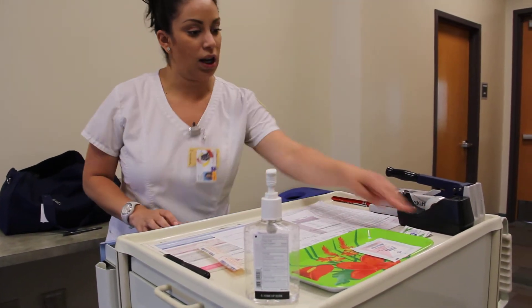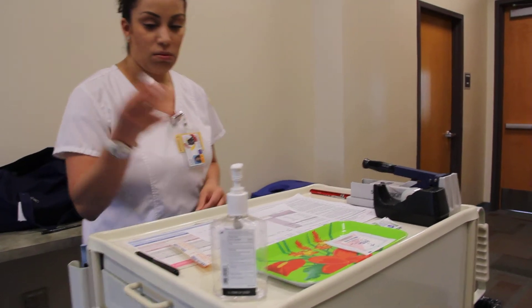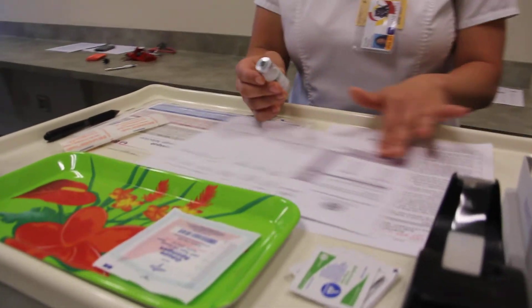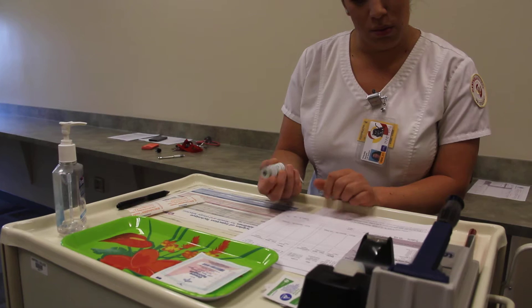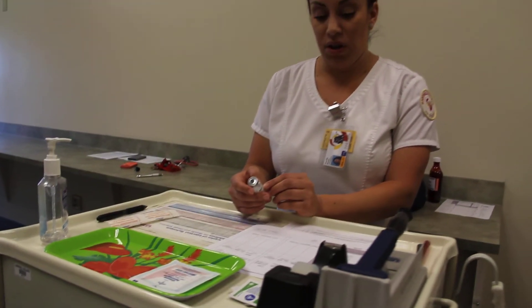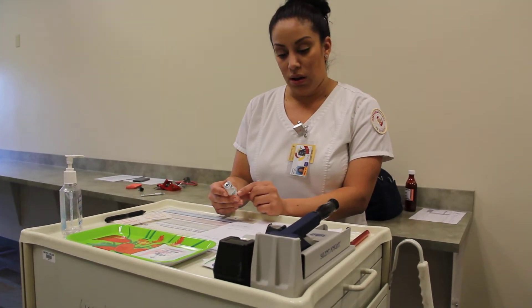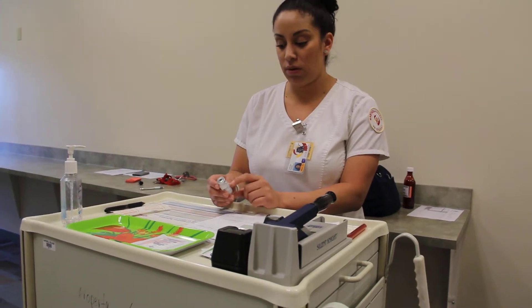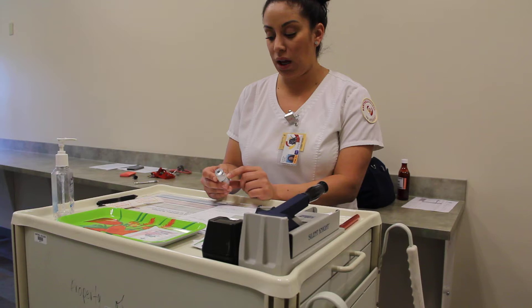I'm going to pick up my first med, which is the NPH, and do my five rights again for each medication. Right patient is Mary Smith, right drug is NPH, right dose is 12 units, right route is sub-Q, and right time is 900.